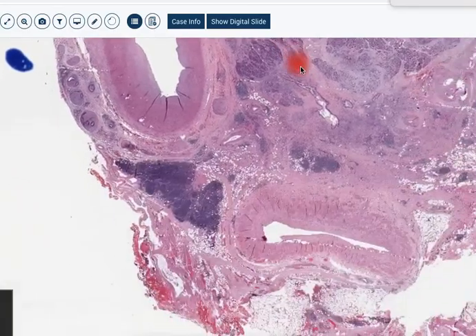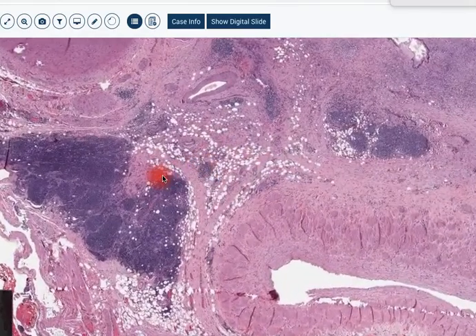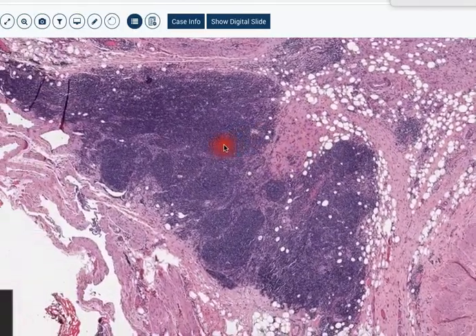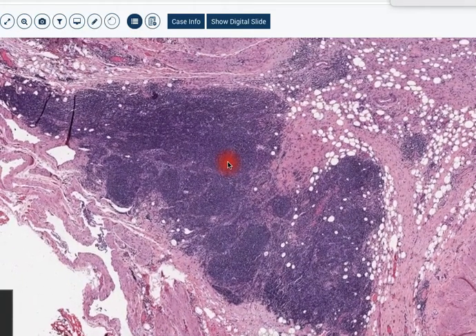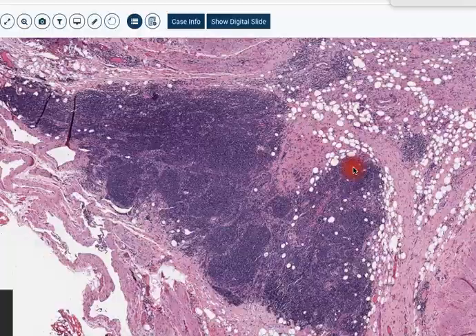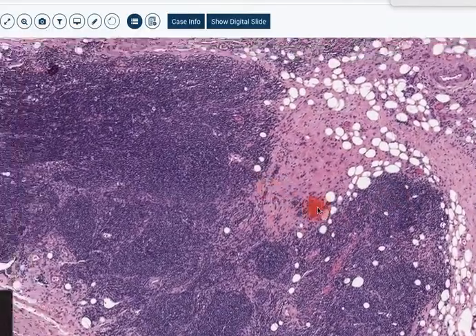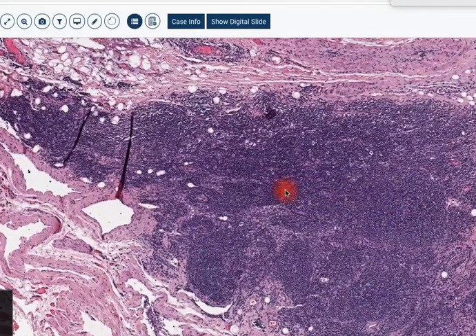Now, we haven't looked at the lymph node, which we should also look at here, because lymphatic invasion, either direct extension or involvement of the lymph node, would also be an important prognostic as well as defining diagnostic feature. But in this case, it looks as though the lymph node here has not been invaded and is still pristine or naive relative to the tumor.